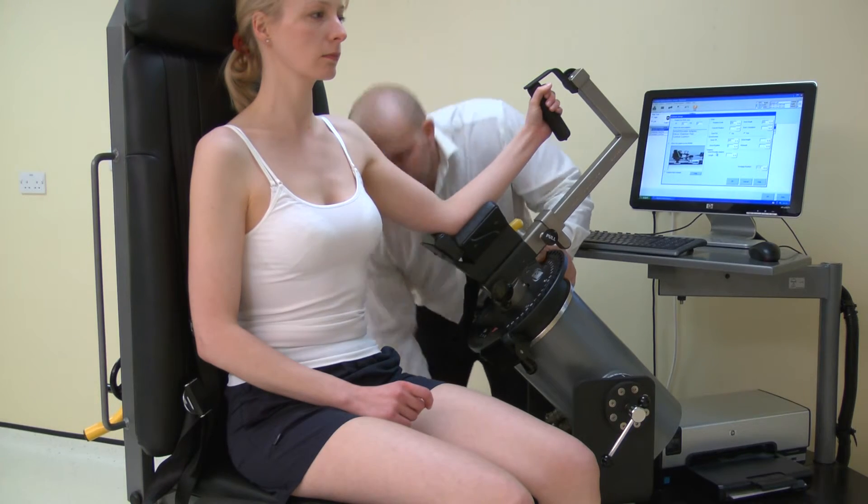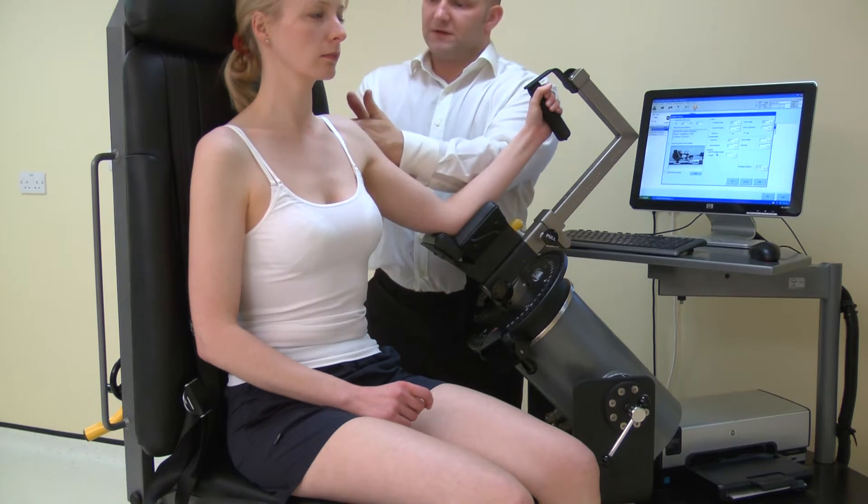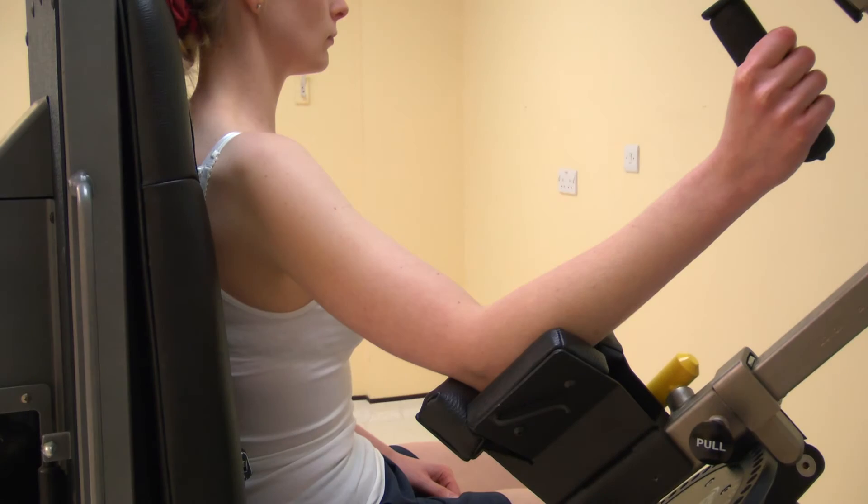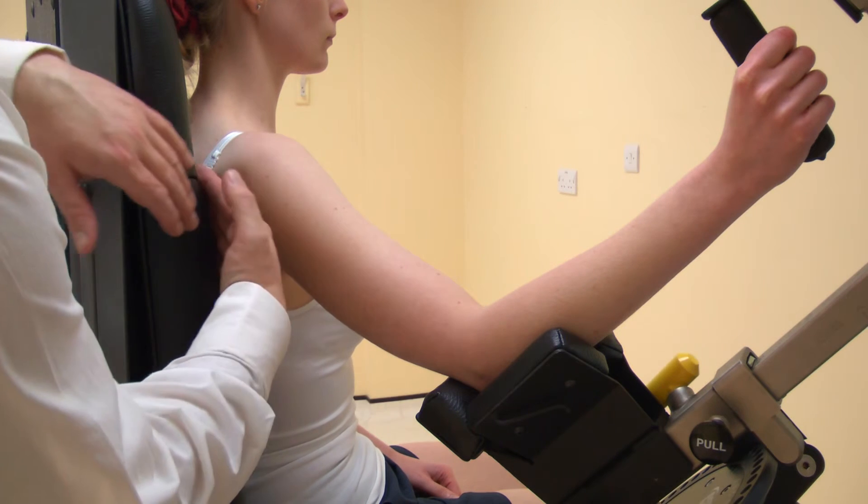Now adjust the scapular angle. The neutral scapular position is 20 degrees protraction. This can be adjusted by rotating either the dynamometer or the chair.